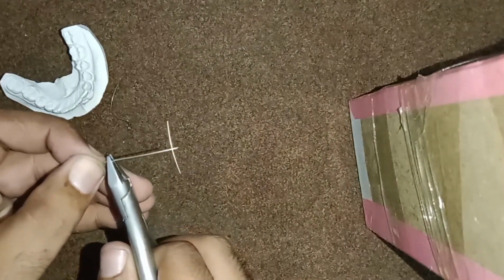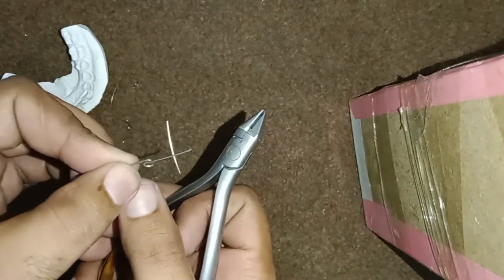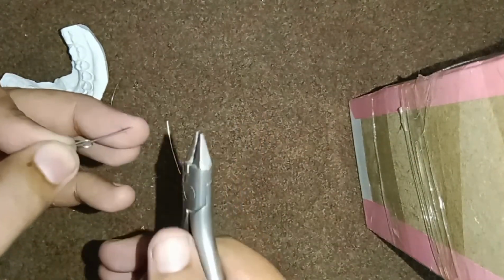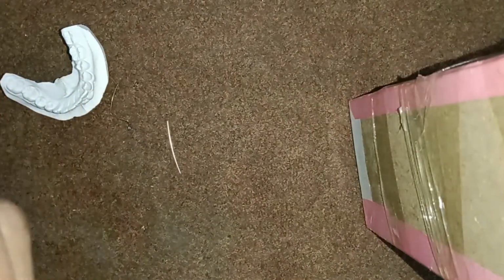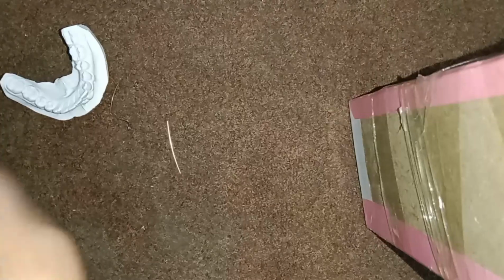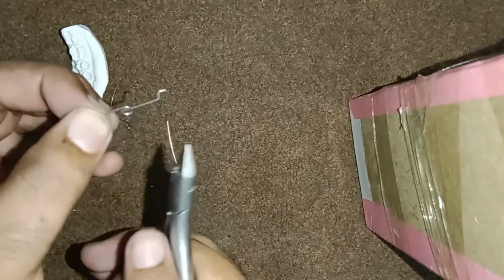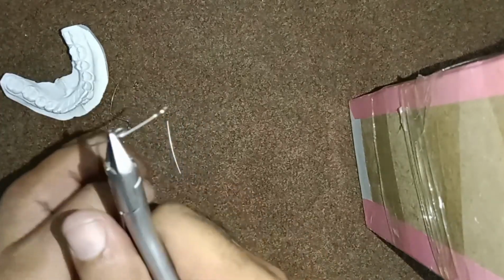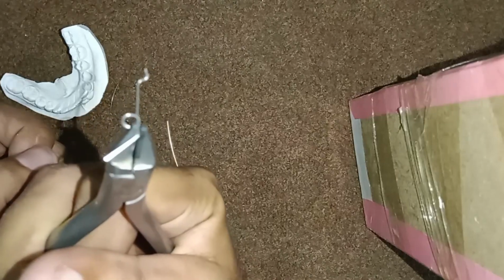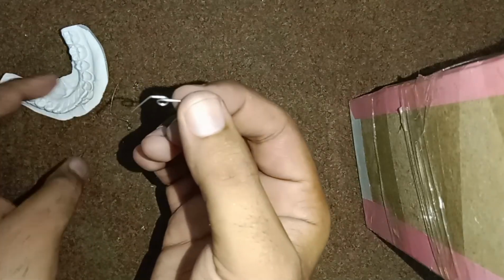For the third piece we will make a loop. We have made a loop and we will make a hook at the anterior segment. This way. Distal to the loop, we will give a 25-degree downward bend for activation of the 3-piece intrusion arch. This is the final piece of the 3-piece intrusion arch.